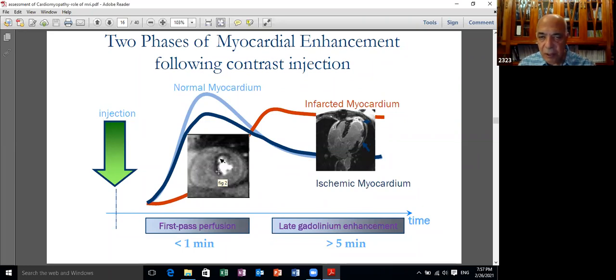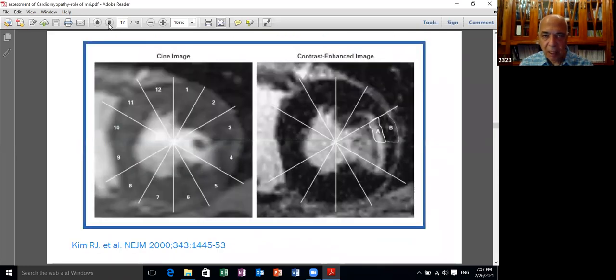Now the important point about MRI is a huge capability to detect small subendocardial infarction, which cannot be seen with any other modality. It can detect an infarction as small as 1 gram of tissue, or less than 1/1000 of the left ventricular mass, and its resolving power is 20 to 40 times the nuclear power to detect myocardial infarction. So these are major advances in the field of ischemic heart disease for the MRI.